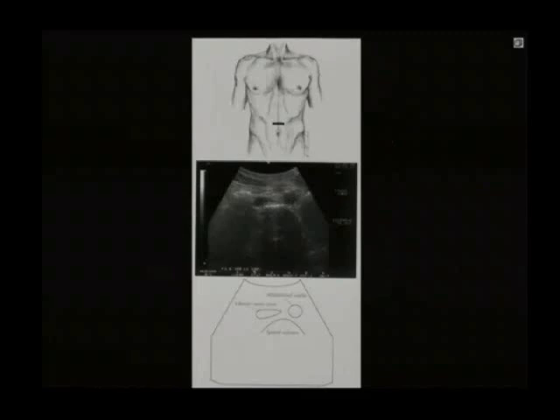If there is a question whether the organ you are looking at is arterial, you can put Doppler on, you can put color flow, but it's not usually necessary. You can usually see that this is the vertebral body, this is right above it, this is on the left side of the body, this is the aorta. The aorta will be a little bit pulsatile as well. The IVC can be a little bit pulsatile because it's right next to the aorta. The IVC in thin patients will also be compressible.